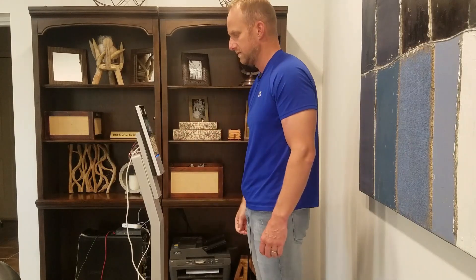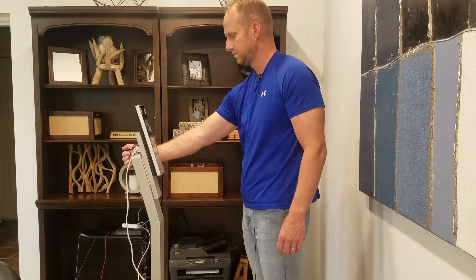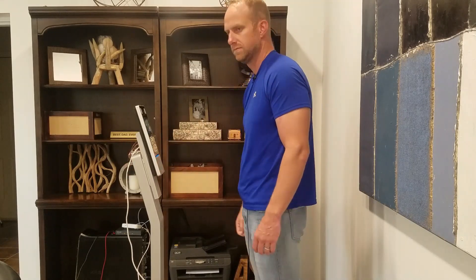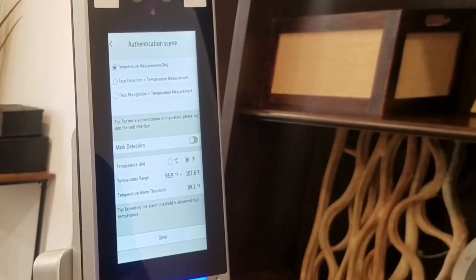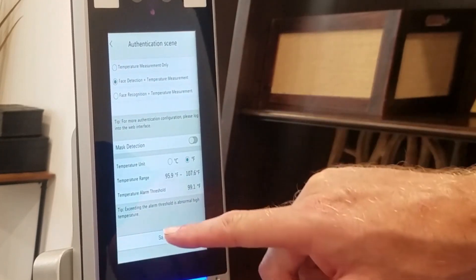For example, if I try to just read my temperature without standing in front of it, the panel shows a temperature reading but gives no output or authentication. I actually have to be standing in front of it. To set face detection plus temperature measurement, just checkmark that box and click save.